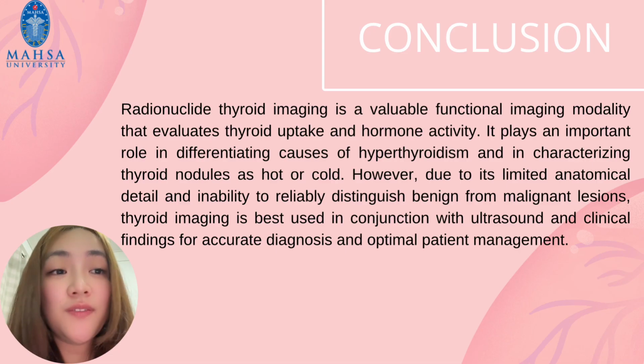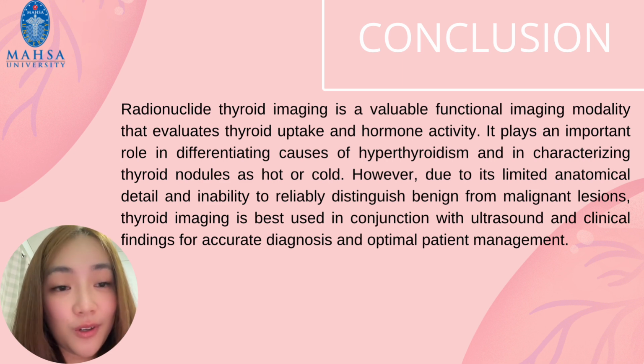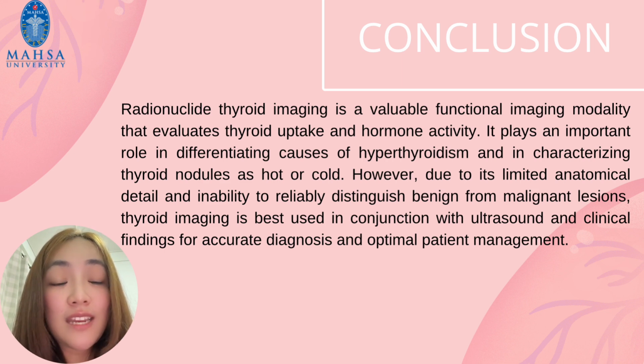In conclusion, radionuclide thyroid imaging is a valuable functional imaging modality that evaluates thyroid uptake and hormone activity. It plays an important role in differentiating causes of hyperthyroidism and in characterizing thyroid nodules as hot or cold. However, due to its limited anatomical detail and inability to reliably distinguish benign from malignant lesions, thyroid imaging is best used in conjunction with ultrasound and clinical findings for accurate diagnosis and optimal patient management.